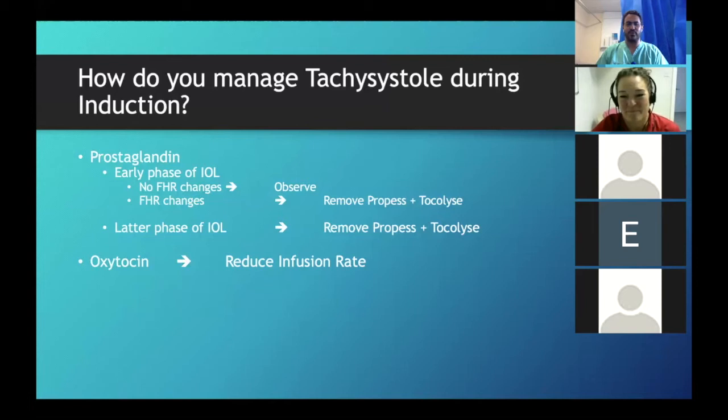Am I making things more confusing now? I'll tell you what I was talking about. So Susanna quite often prescribes terbutaline to women on the antenatal ward. She says that even though the contractions aren't strong enough to cause decels, just having more of a tonic uterus can cause the baby's heart rate to rise. So I'm sure you've done it before as well. You've given terbutaline and then the heart rate comes down.